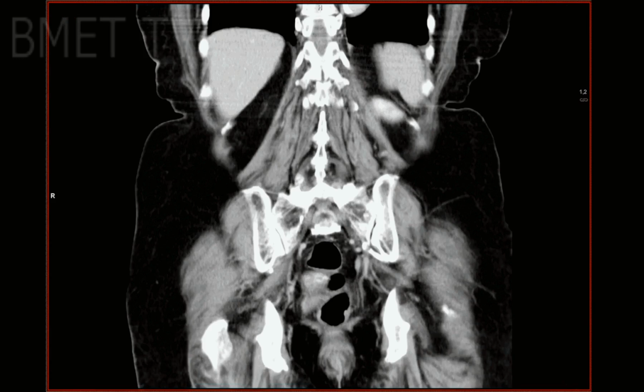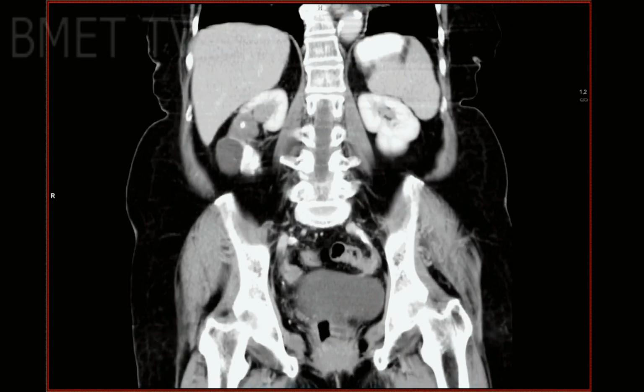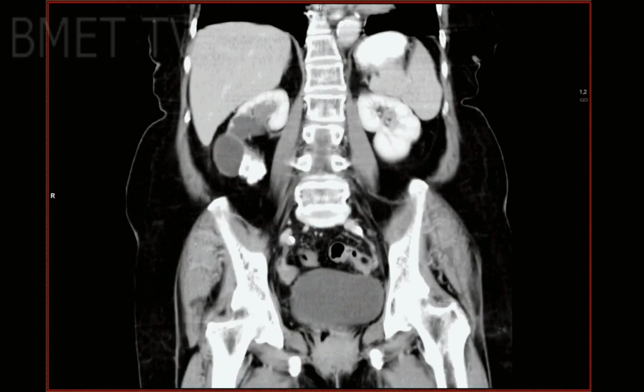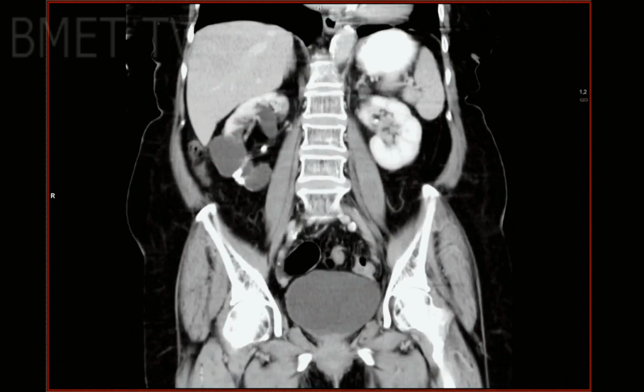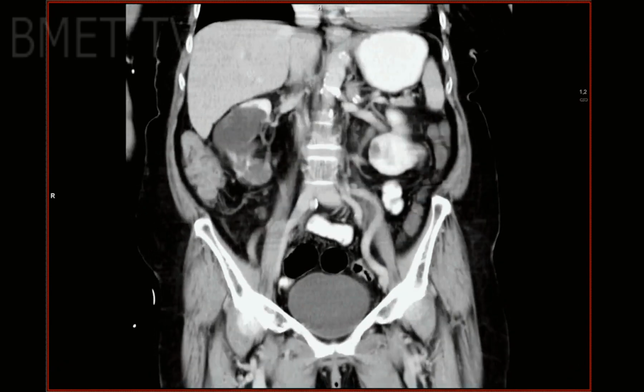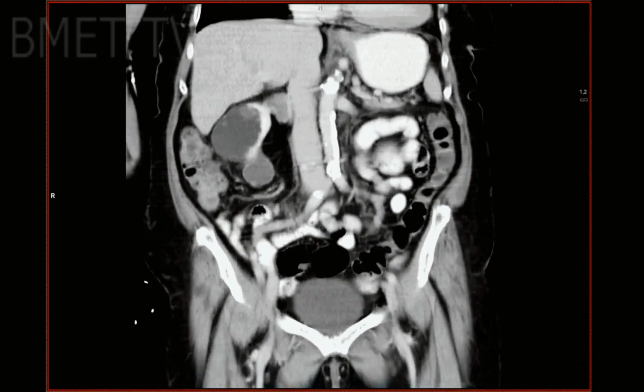CT abdomen scan. During an abdominal CT scan, a technologist will capture images of the organs of the digestive tract such as the intestines, colon, liver, spleen, and appendix. A doctor might order an abdomen scan to detect abscesses in the area, to discover internal bleeding, or to identify and diagnose tumors such as those in the colon.